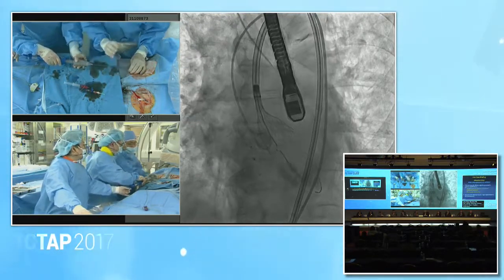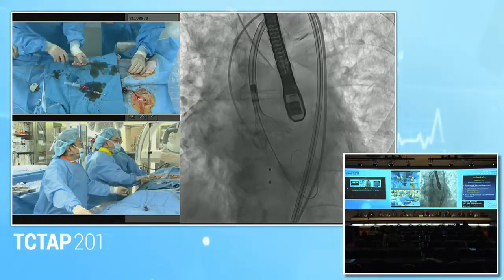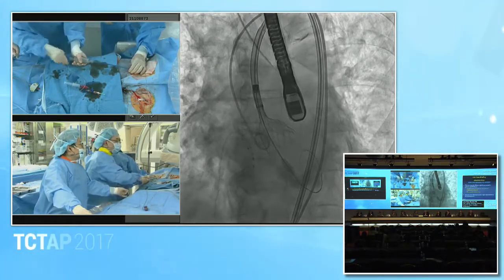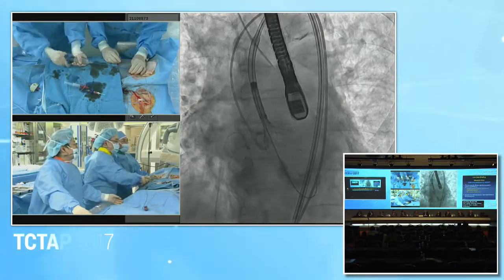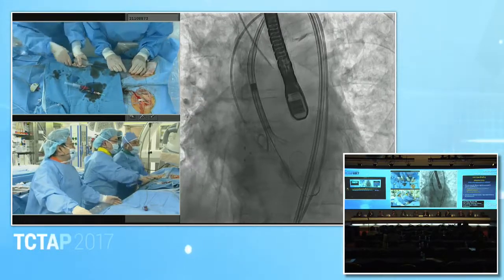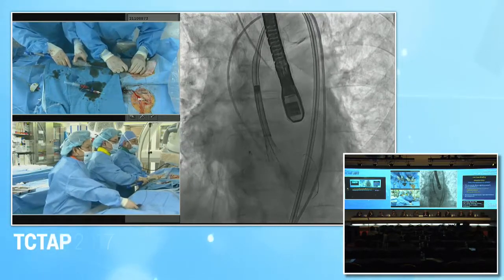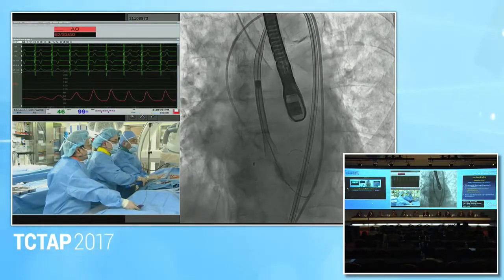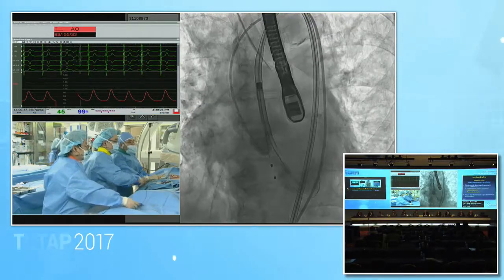Yeah. The only thing is to apply some pressure. We are doing recapture. Yeah. So if there's no AR, I would probably have left it and deployed. Oh, okay. Just a moment. Oh, you decided to recapture. Okay. Yeah, recapture. Yeah, test it. So of course you can also play with the wire in this particular portion.